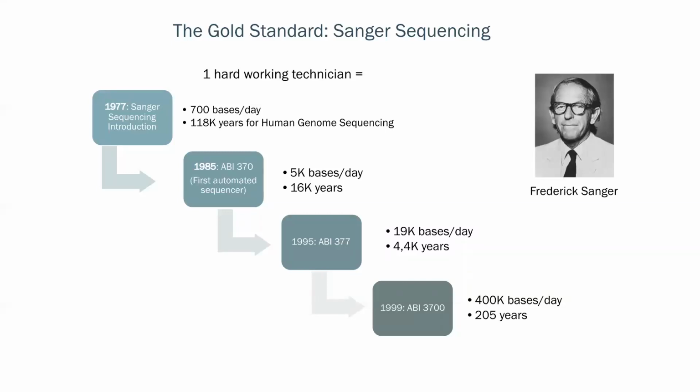First, Sanger sequencing serves as an orthogonal method for confirming sequence variants that are identified by next-generation sequencing. When validating clinical NGS tests, reference materials sequenced by Sanger approaches provide ground truth, which the NGS assay can be benchmarked against. These materials may include well-characterized publicly available reagents, such as cell lines studied by the HapMap project, or archival clinical samples that are tested by Sanger methods.